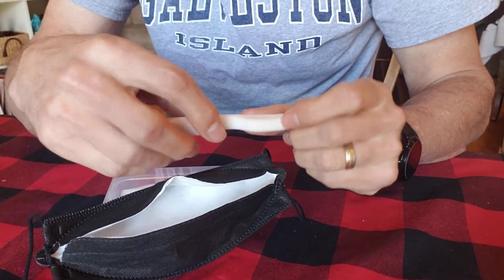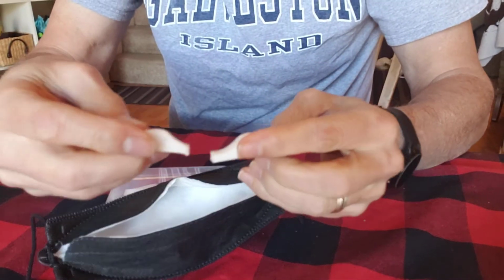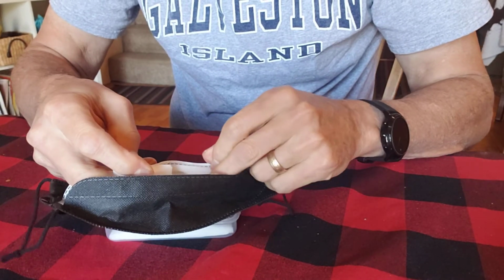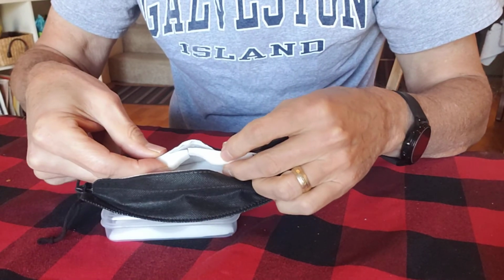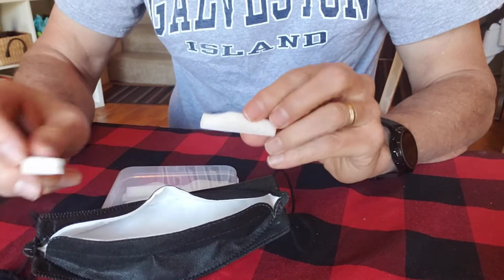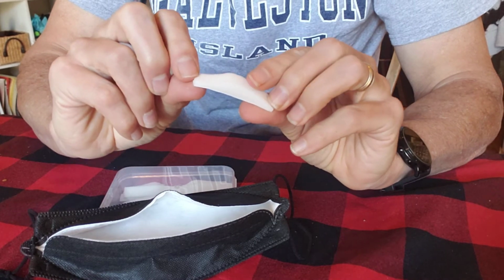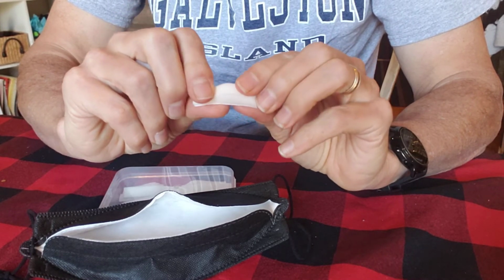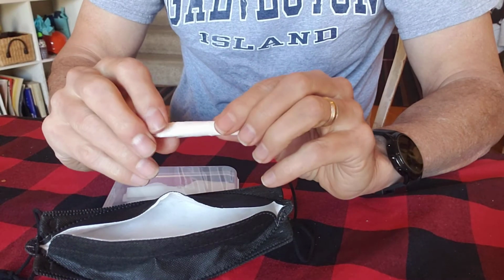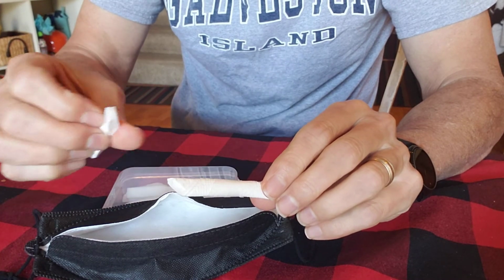So that doesn't work. So I actually tried cutting them right in the center into two and then putting them where I wanted. And you still got these ledges to deal with. So I even trimmed up the ledges and it still didn't work. And really what it is, this is just a little stiffer, and so the mask has to work a little bit to bend that, and it's just easier for the mask to conform to the soft toilet paper than it is this spongy stuff.